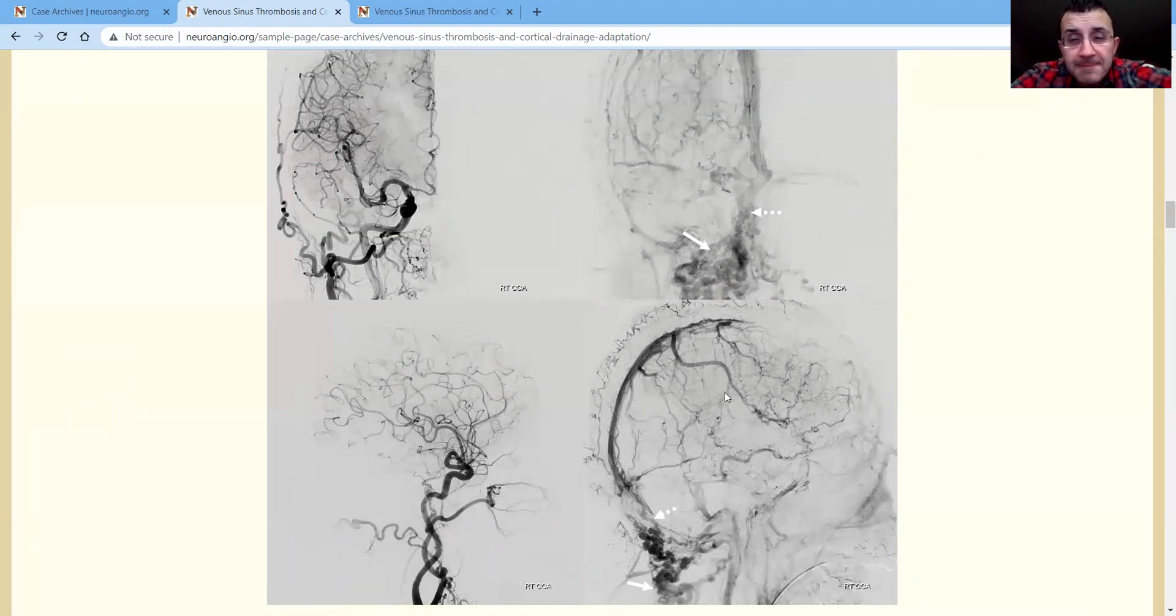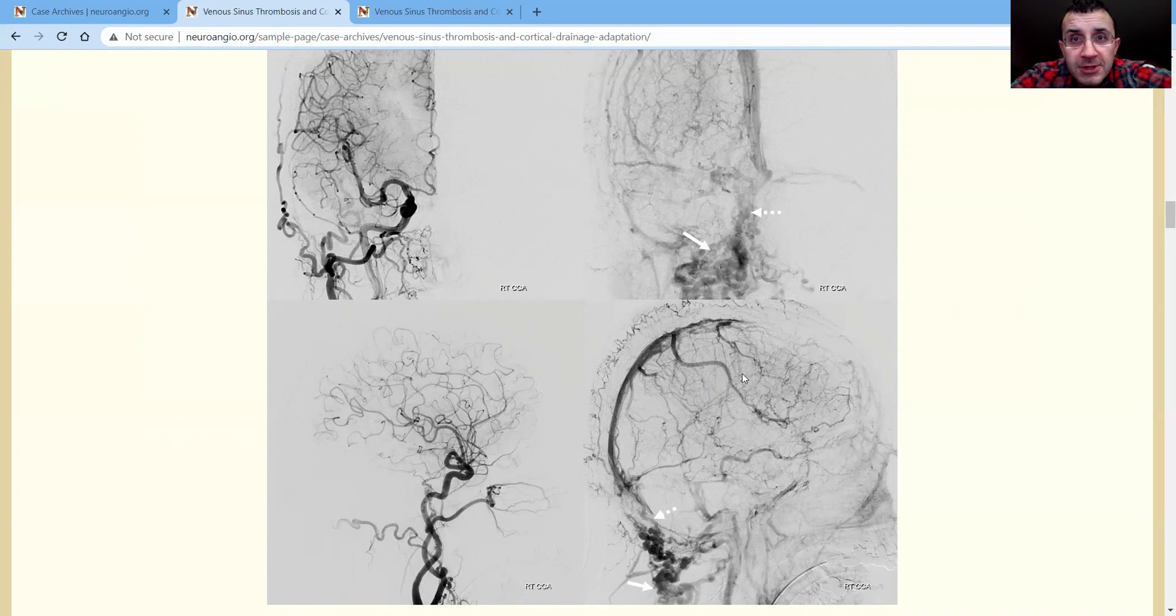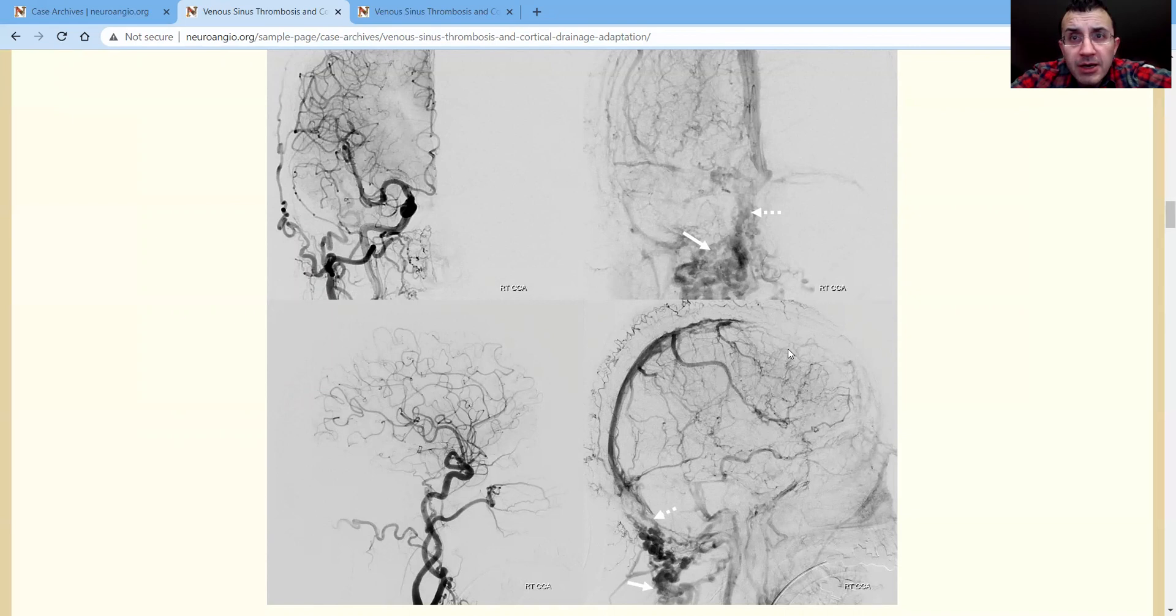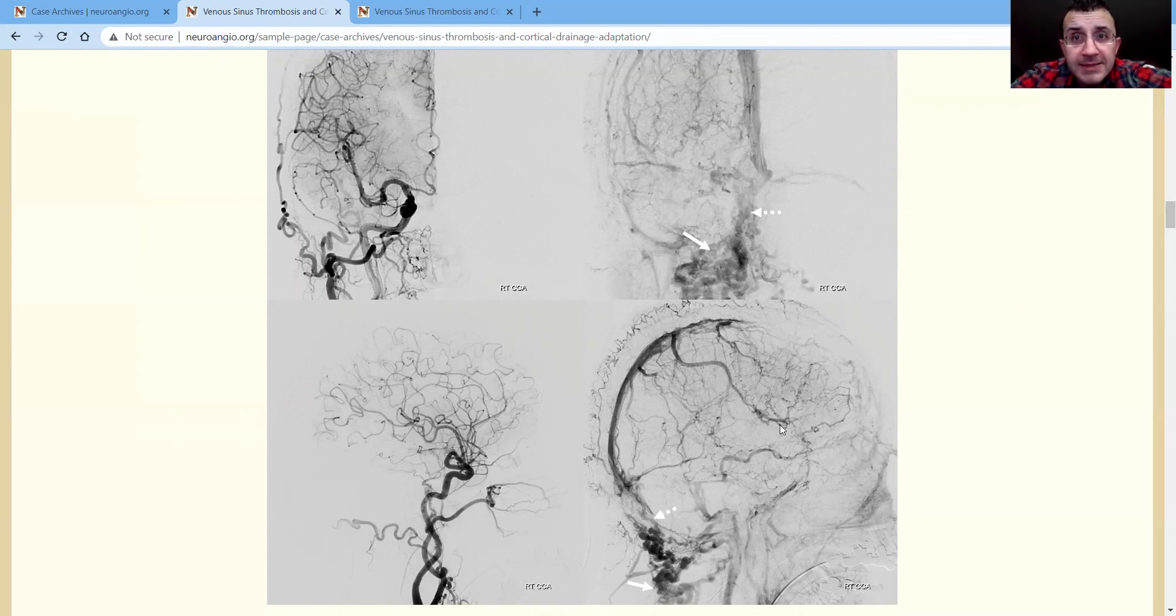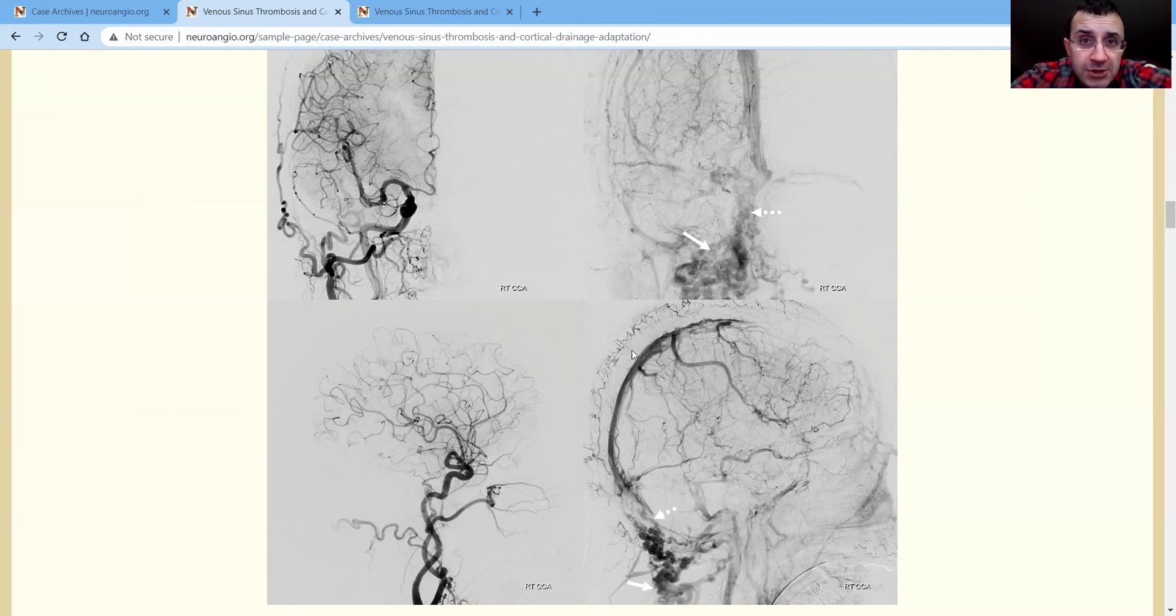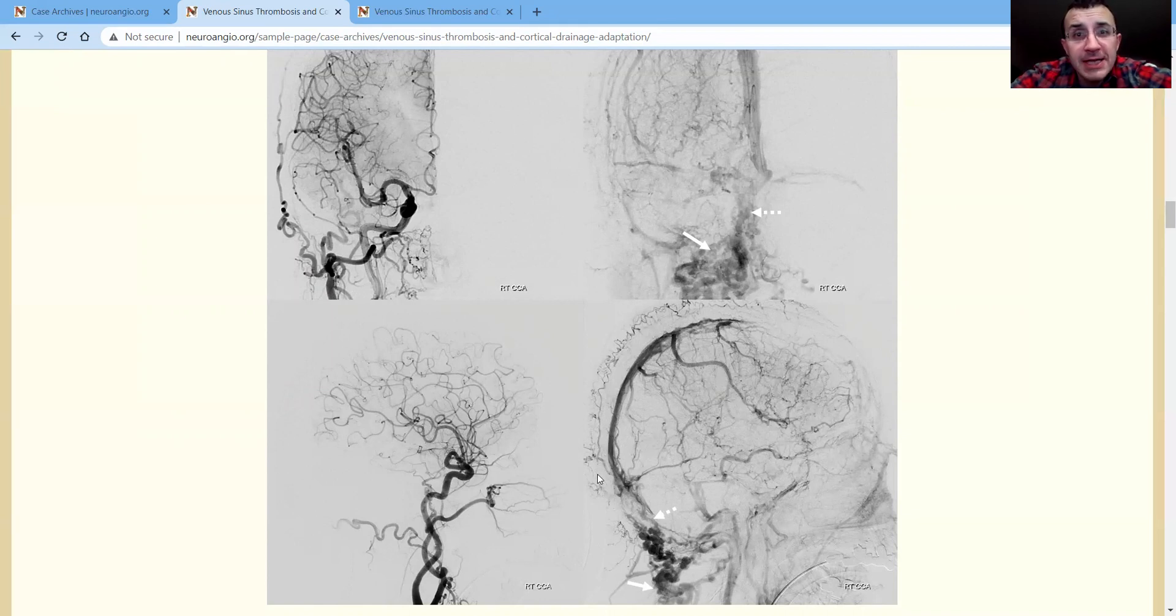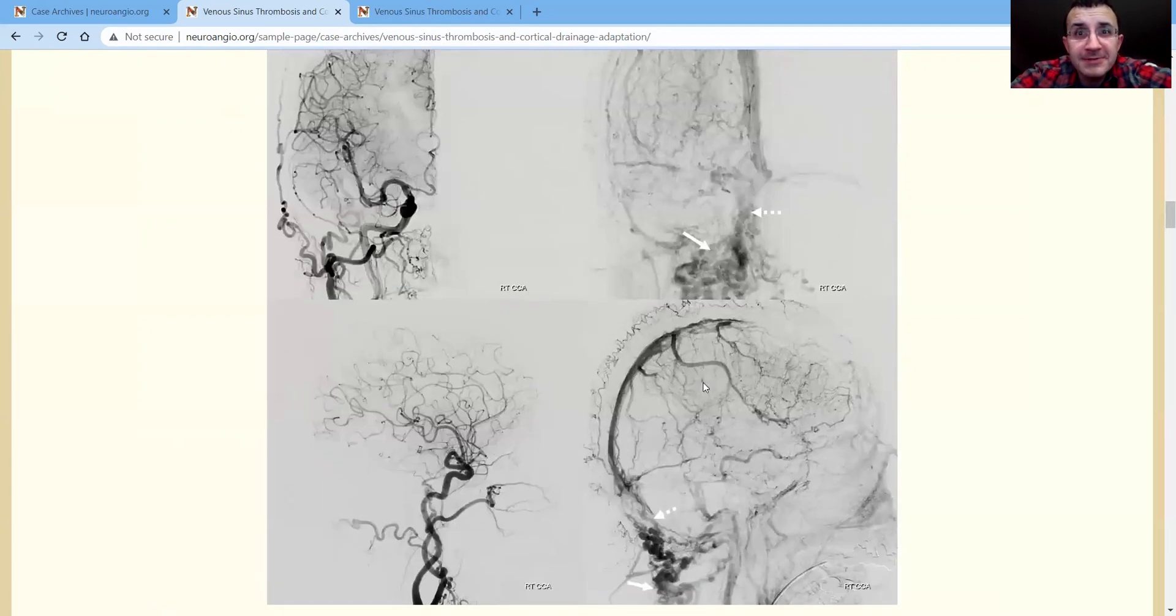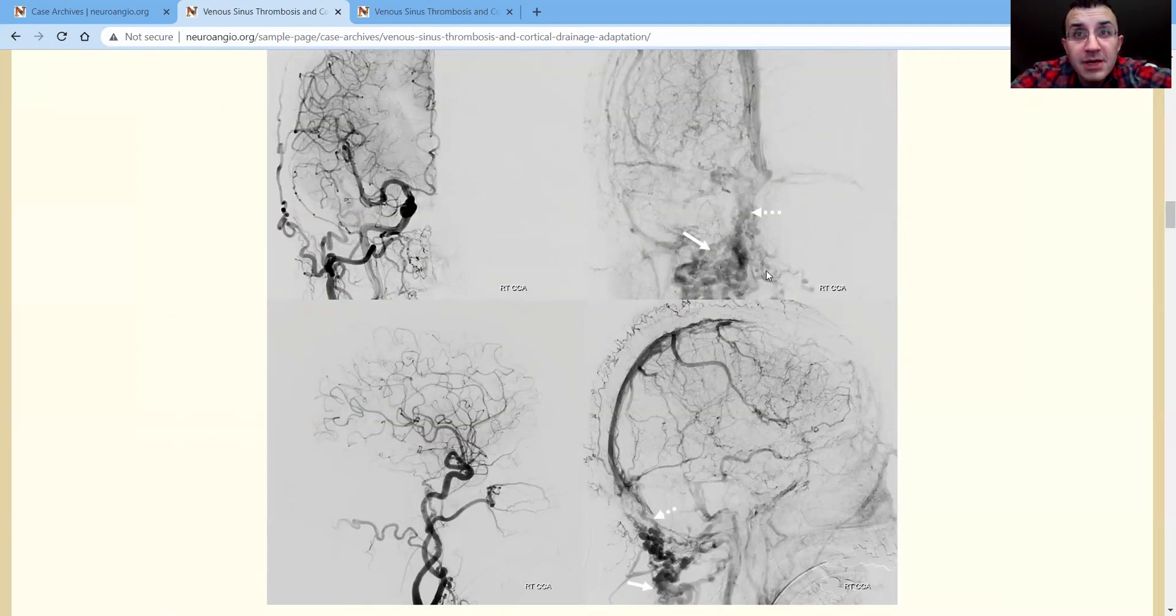Well, it's going to drain somewhere. It's draining into this Trolard system. All these surface cortical veins are having some hard time, but ultimately they're finding their way successfully, as you know from the MRI, into this Trolard, which drains via the patent portion of the superior sagittal sinus into this very obviously impressive mass of veins here. Now, what those are, those are suboccipital veins, venous plexus.